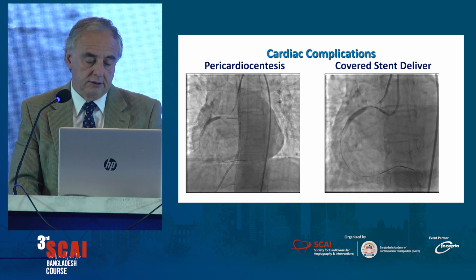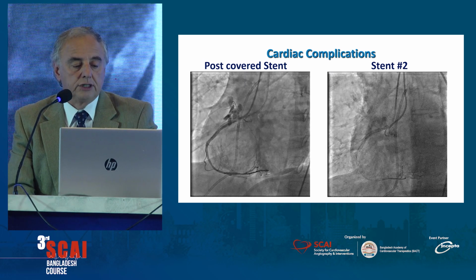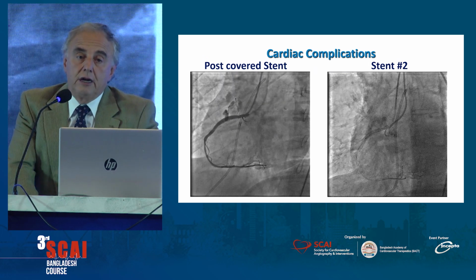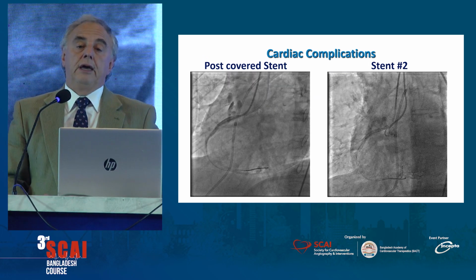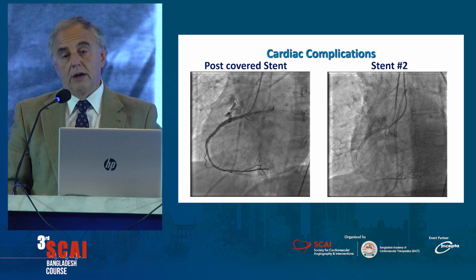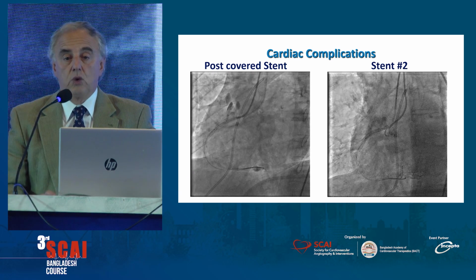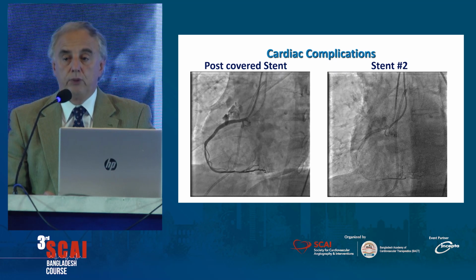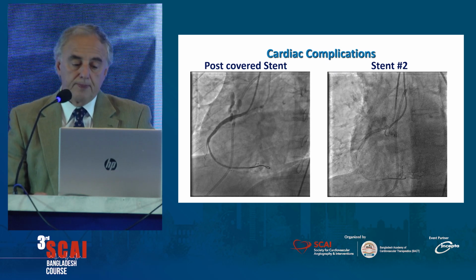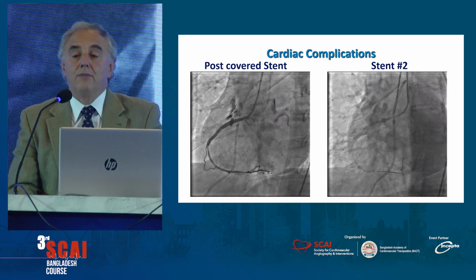Sometimes the cover stent does not work, and you see after we put the cover stent, there was still a very sizable perforation. So there are different things that you can do here. You can use a larger balloon and expand the cover stent more. Some people are concerned about a larger perforation. It's unlikely because you have the cover stent. Sometimes the cover stent will not expand in the edges, so you may put a non-compliant balloon to expand this stent.